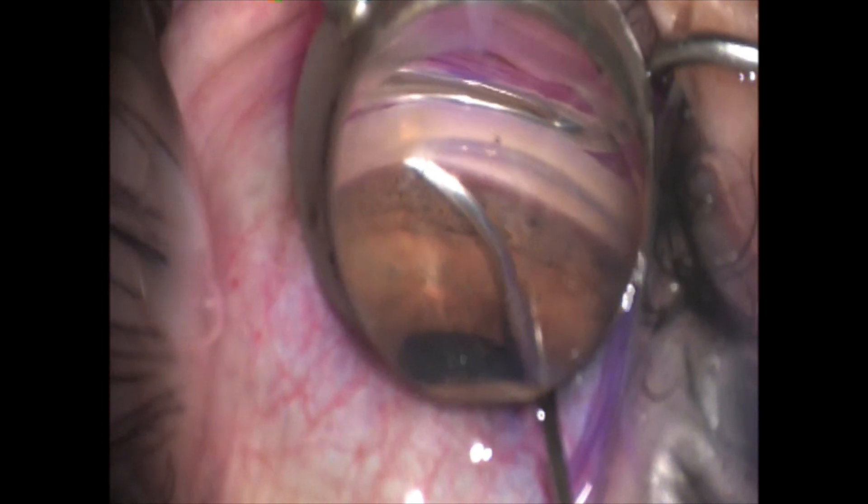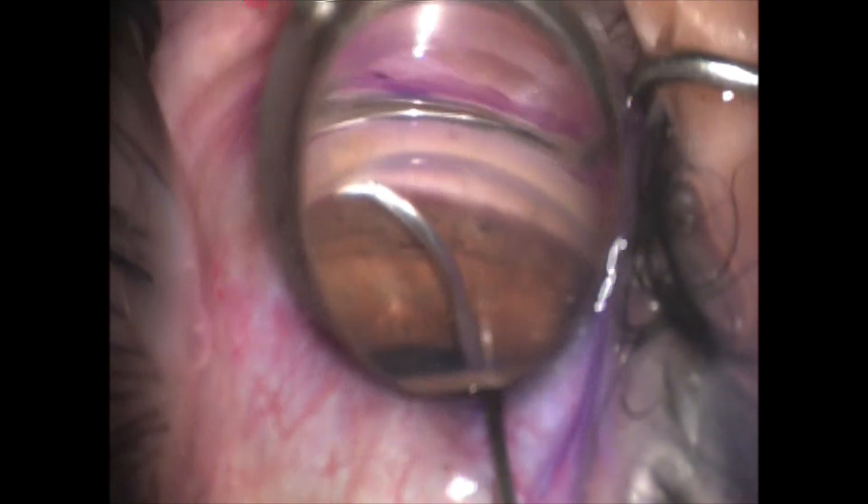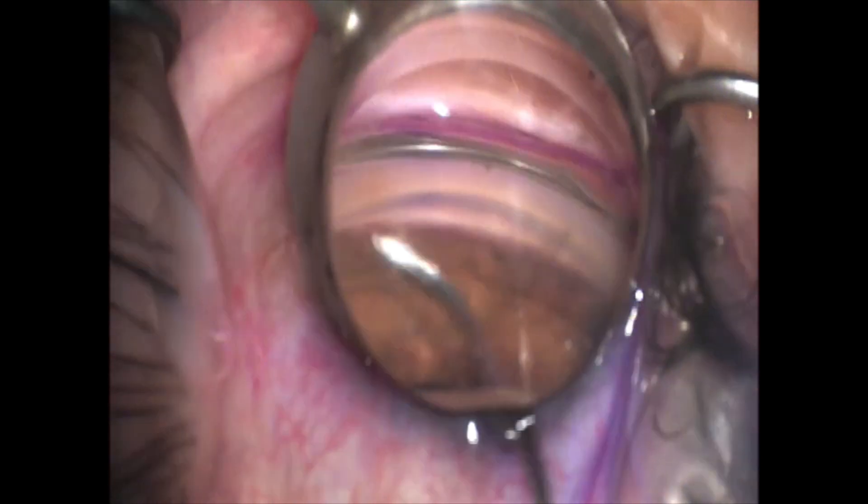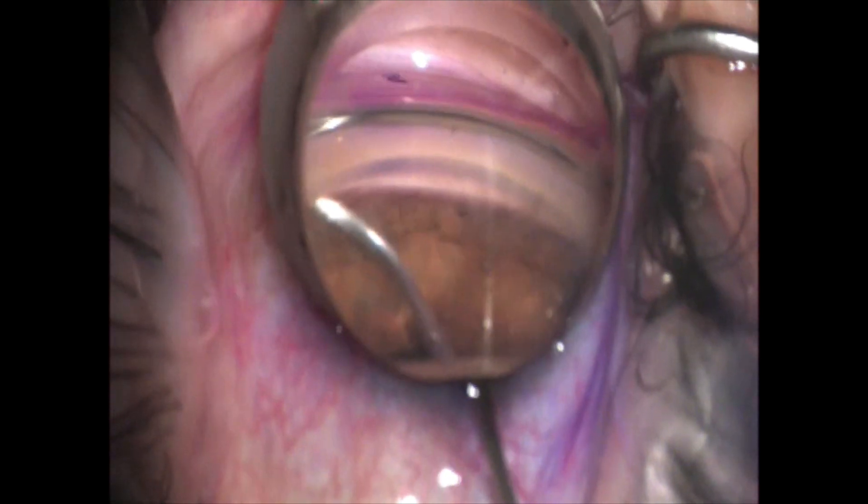Here you can see I made my initial small goniotomy. I'm not getting the exact penetration that I want, so I'm backing off and I'm just going to enlarge that site just a little bit.